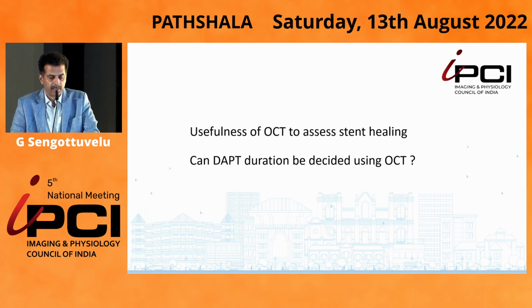Thank you. Then I would also like to point out the usefulness of OCT in assessing stent healing. I think it was really helpful here, as well as there are some areas where we can even use OCT, particularly in the first generation drug-eluting stent, to decide on whether to continue DAPT. OCT may be useful to find out whether we have a well healed stent.